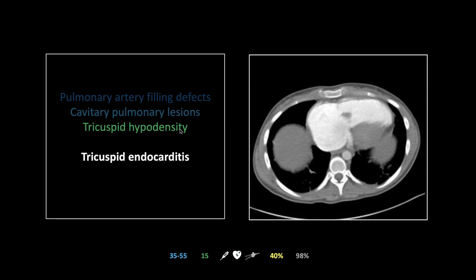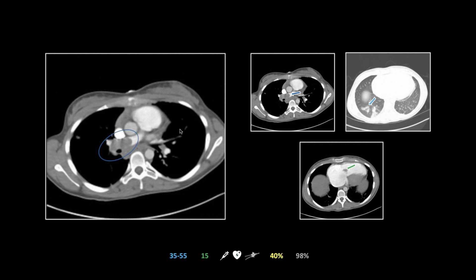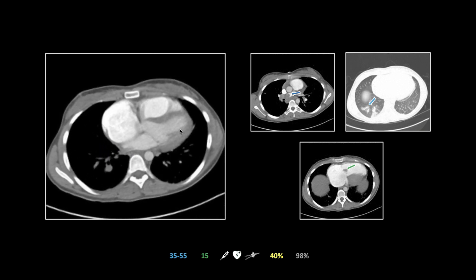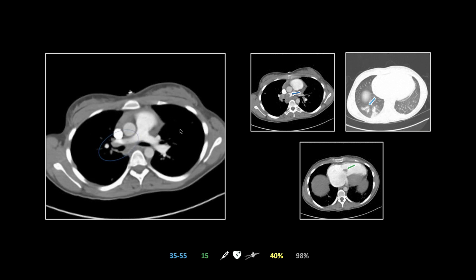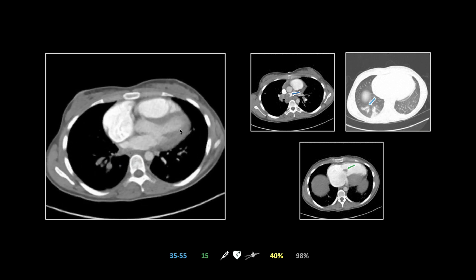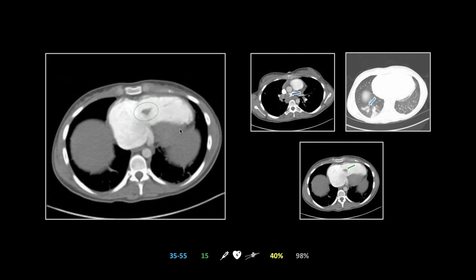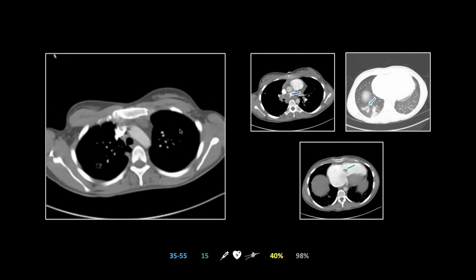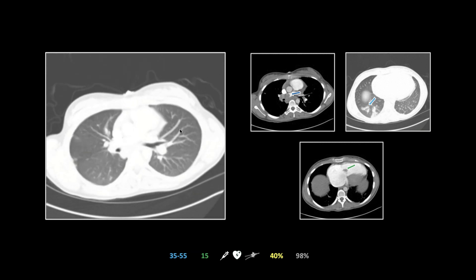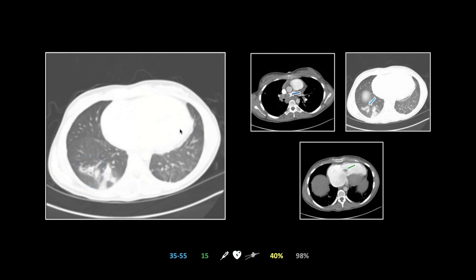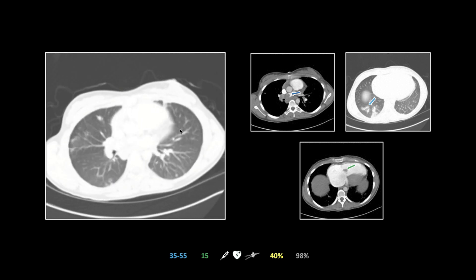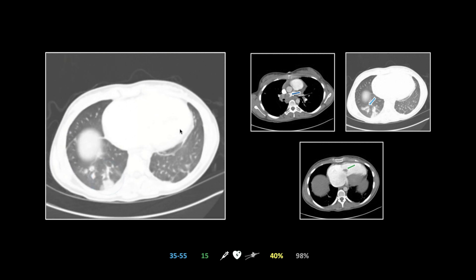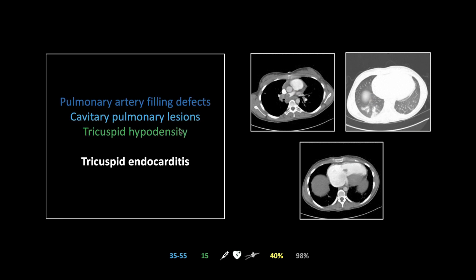Here is the right pulmonary artery filling defect going all the way down into the right lower lobe, and there is that vegetation on the tricuspid valve. You can see the hepatic venous backflow under the diaphragm, suggesting tricuspid regurgitation, and look at the size of that right atrium. On lung windows you see a bunch of little cavitary lesions — it is sometimes helpful that these are peripheral in diagnosing septic emboli, though they don't always have to be. That is a case of tricuspid endocarditis.